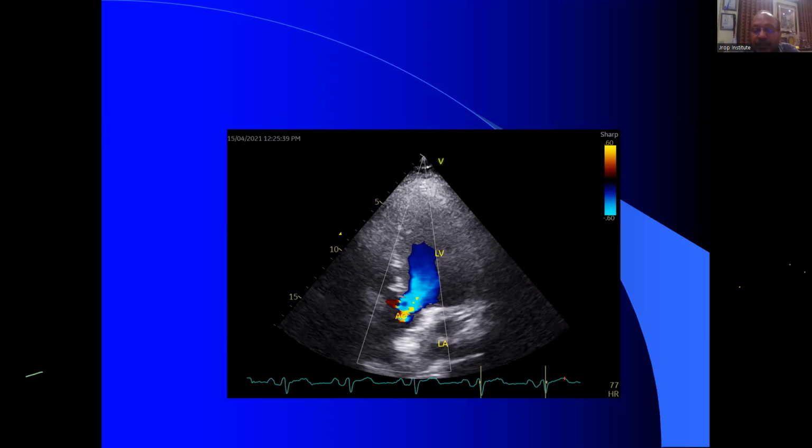Because this Nyquist limit is, if you put it on, a VIBGYOR scale: violet, indigo, blue, green, yellow, orange, red. Right. So if this scale is blue in color, look at the blue top and the blue bottom, the color is changing from dark blue to light blue. As the velocity is decreasing, or approaching towards -60, the color is changing. That's what I'll try to show you when I show a live demonstration. Give me some time before we do the live demonstration.